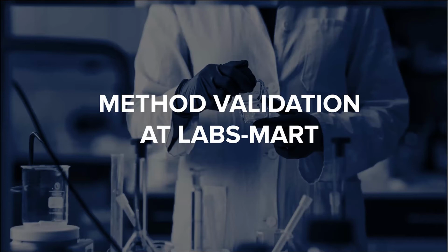As part of this development, a lab should be assessing the method's likelihood of successful completion of validation. These quote-unquote pre-validation experiments are crucial in identifying potential shortcomings in the method. By addressing these issues prior to the execution of the validation protocol, the laboratory has a greater chance of success during validation. However, it should be noted the laboratory should have a process of documenting these method development and pre-validation activities to ensure that none of the pre-validation data results are included in the actual validation.